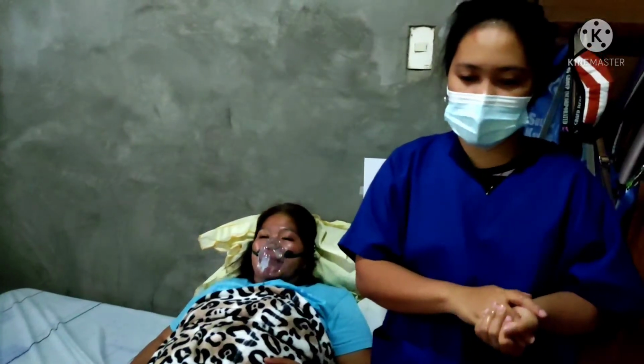Document the procedure, including your pre and post suctioning assessment, the amount, consistency, color, and odor of the patient's secretions, the size of the catheter you used, and the patient's response to the care.